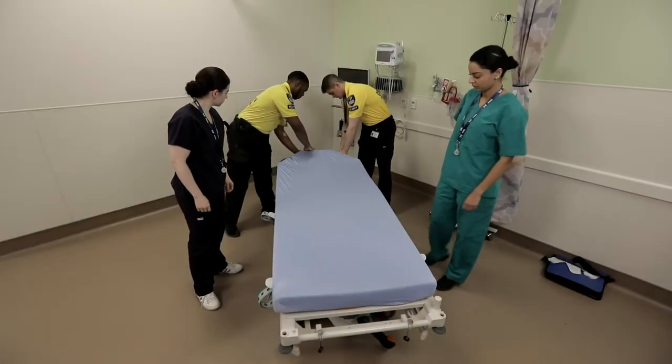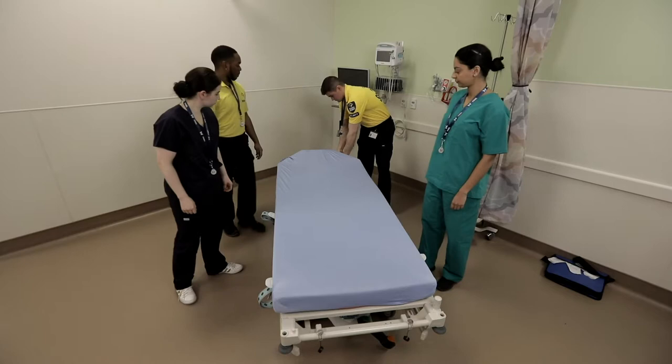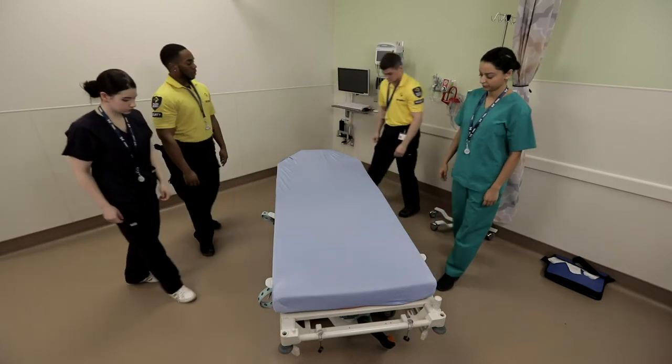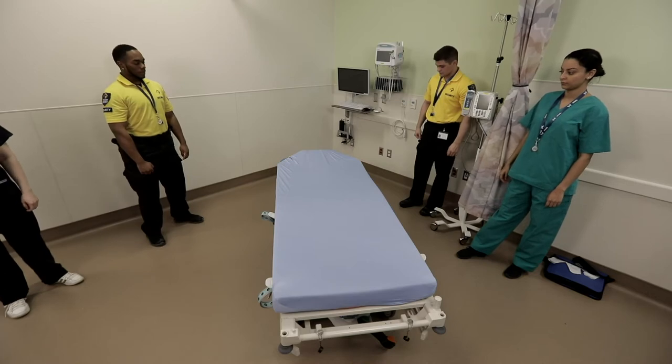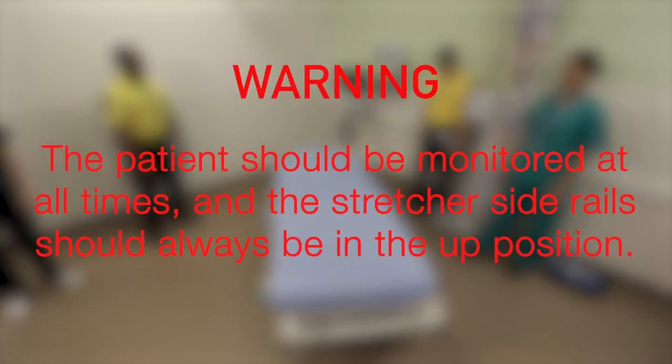For all procedures, adjust the stretcher to its lowest position and lock the brakes for patient loading. The stretcher is now ready for the patient. Warning: the patient should be monitored at all times and the stretcher side rail should always be in the up position.